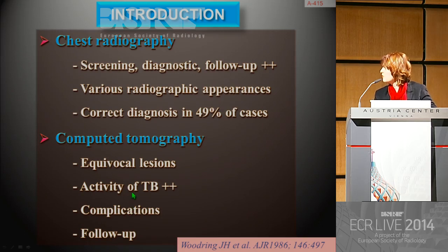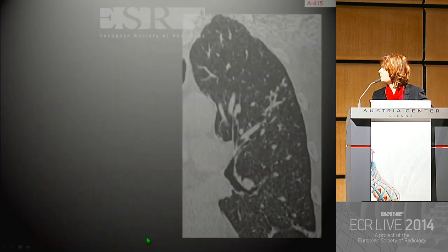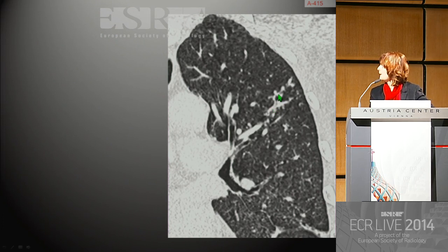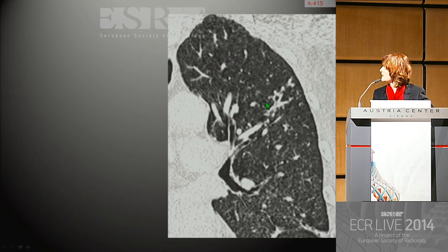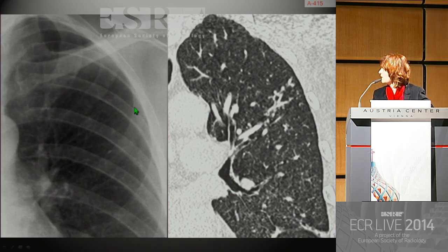CT has also proven very helpful in judging the activity of tuberculosis and for evaluation and follow-up of complex disease. This is an example of typical, well-defined, dense centrilobular nodules with tree-in-bud appearance, which were almost totally missed on the equivalent chest X-ray.